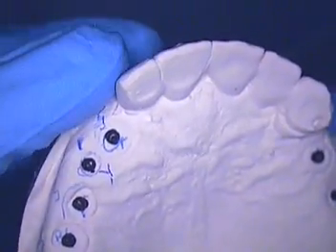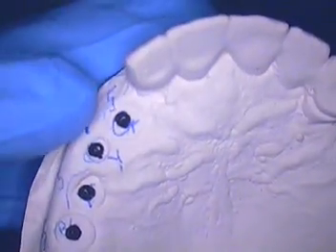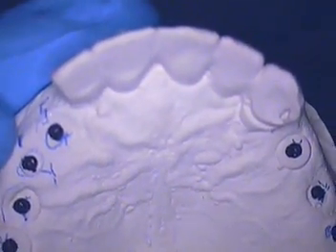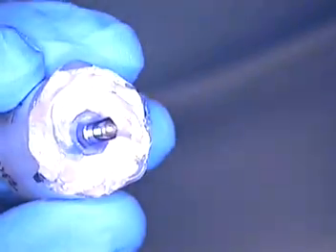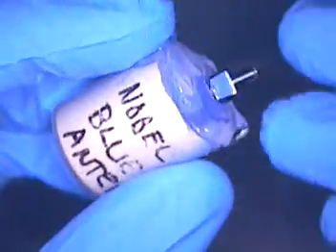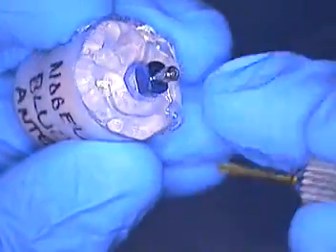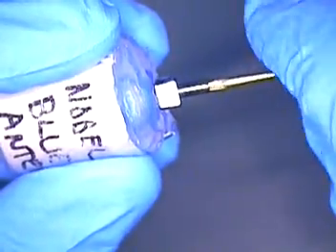Here's that difficult area between these two implants. So I went ahead and ordered some non-flared impression copings — I'll show you that. As most of you know, I have made these jigs, and I've been criticized by some specialists who feel that these jigs are too arbitrary. Let me clear the air on this idea. This is a Nobel Biocare — excuse me — a Nobel Select analog mounted in stone. And then I went ahead and made flared, tapered impression copings.